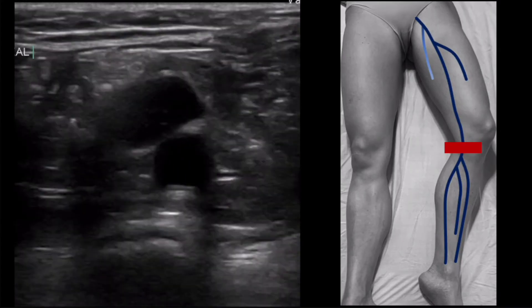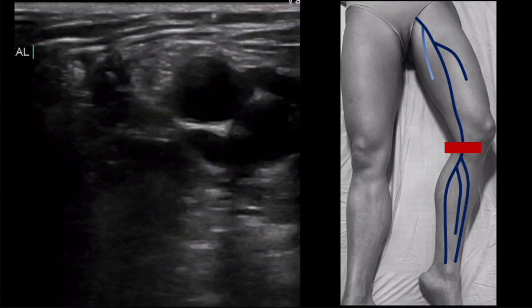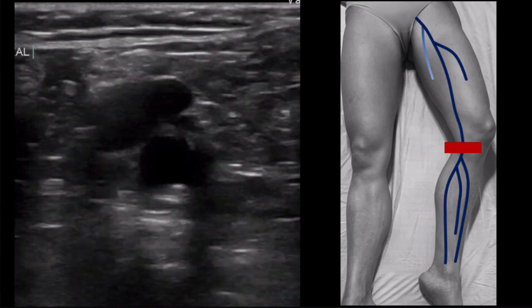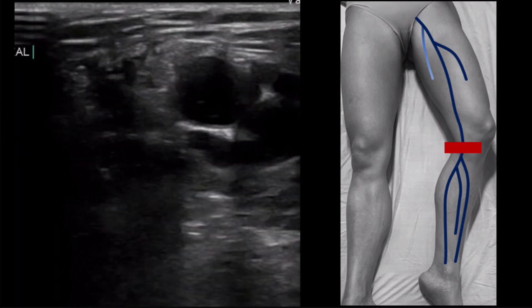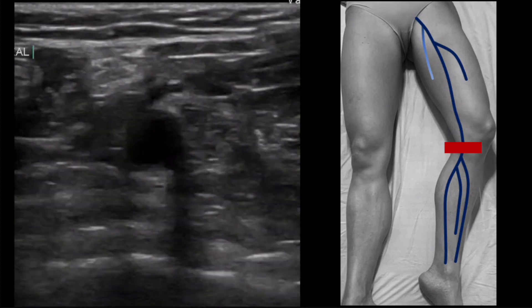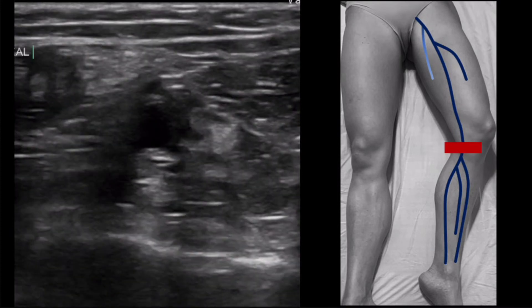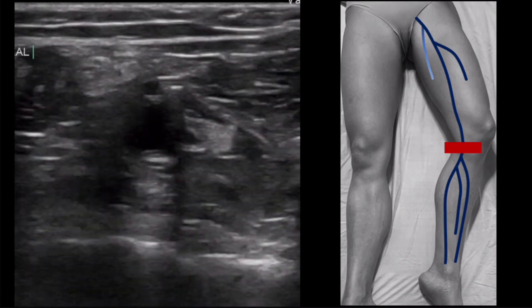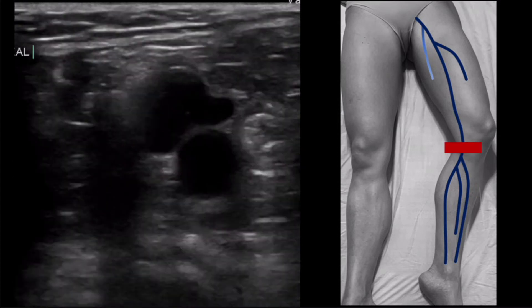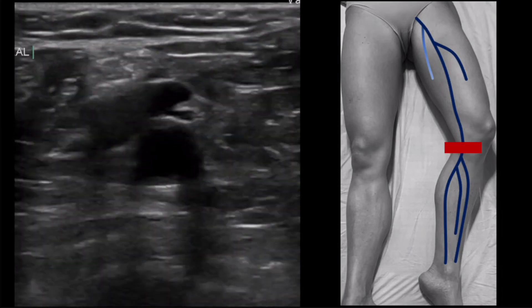After I lose visualization while following the femoral vein, I transition to the popliteal fossa. The first structure I look for is the popliteal artery because the vein sits on top or superficial to the artery. If you only look for the venous structures, I have seen learners compress superficial veins in this region and not actually visualize the popliteal vein. To hammer home a recurring theme, while compression of the popliteal vein is good, following that down into the branch points and compressing along the way with the transition to anterior tibial, posterior tibial, and peroneal veins is better and will increase sensitivity. In this clip, you can see some of those branch points as the operator slides distally.